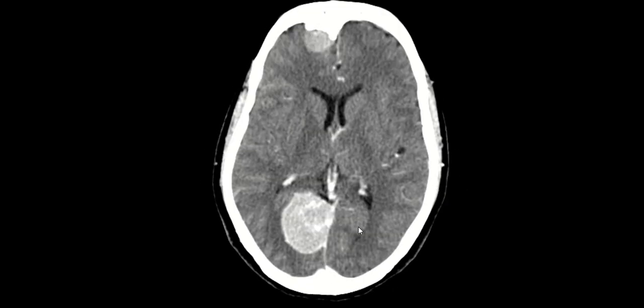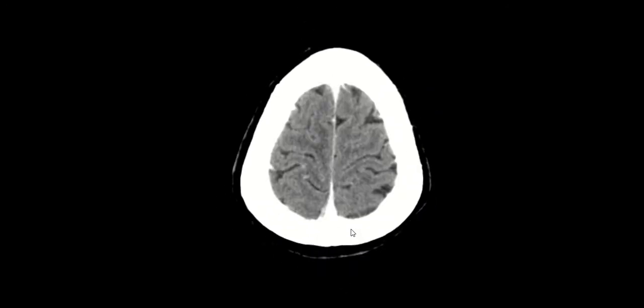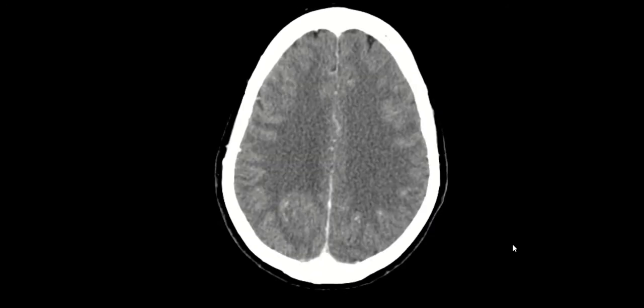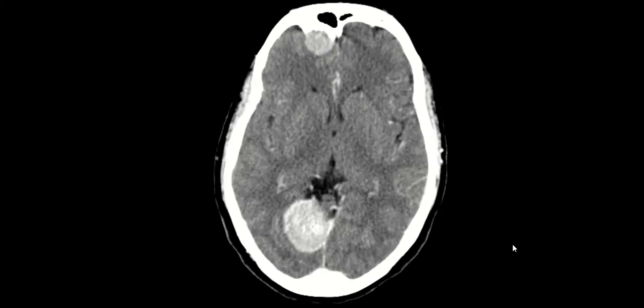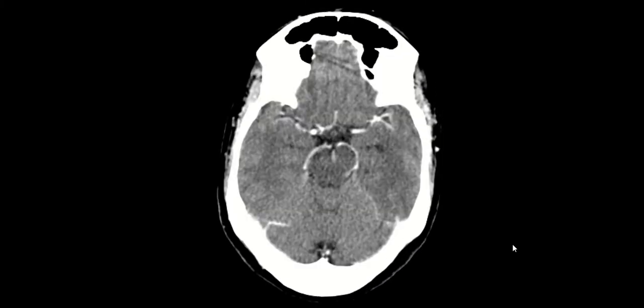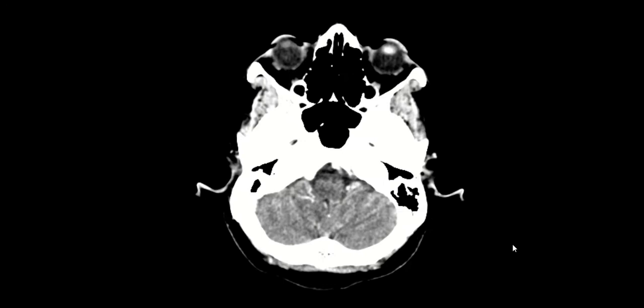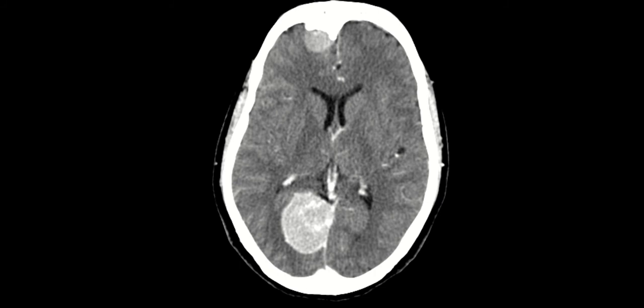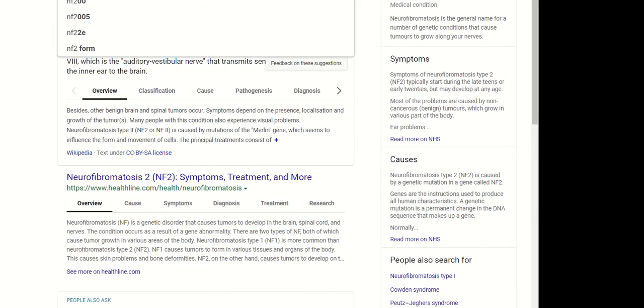It's hyper-enhancing because it's extra-axial and outside the blood-brain barrier. Contrast would hypothetically be useful to detect smaller meningiomas — to rule out meningiomatosis, for example in NF2 — just meningiomatosis.